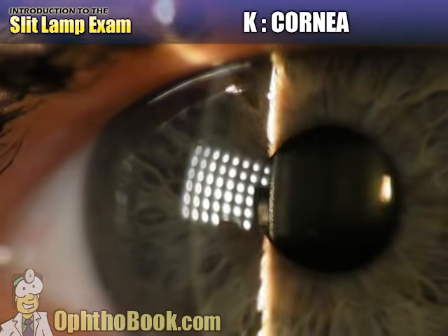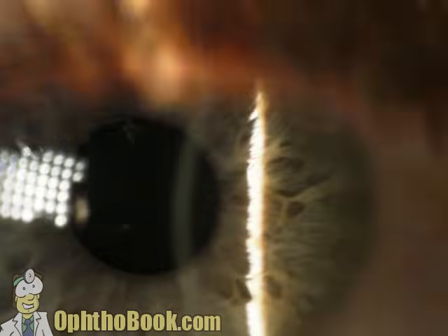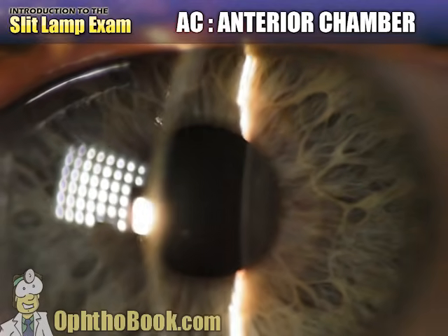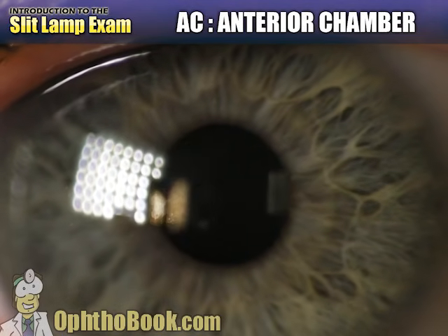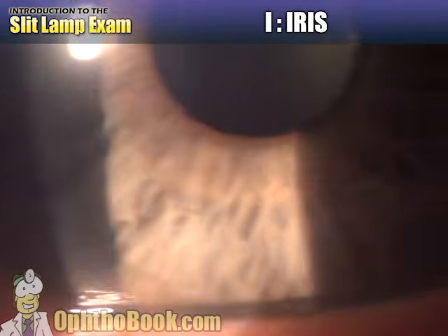And then we look, of course, at the cornea. I make a very thin slit of light, go across, looks clear here, no problems. The anterior chamber, I make my beam shorter, a little bit wider, use the pupil as a black background, it looks deep and quiet. Then we move on to the iris.